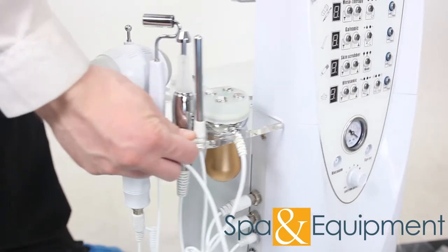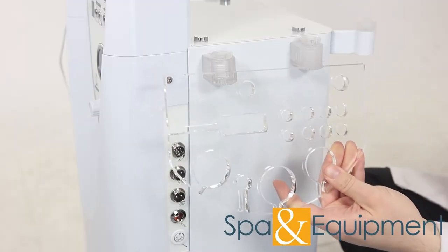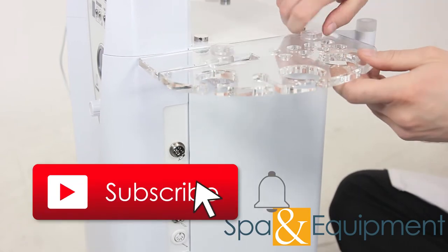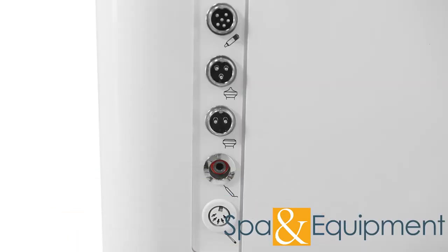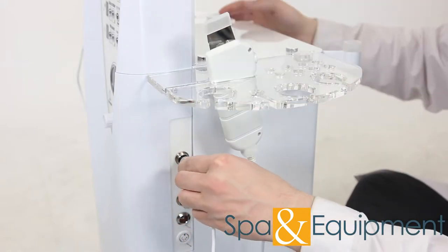Now that all those tools are done, let's move on to the other side of the Sono. Grab the other accessory tray like this and secure it like you did the other tray. The first tool to install on this side is the skin scrubber. Put it into the tray, plug it into the unit, and tighten the lock.